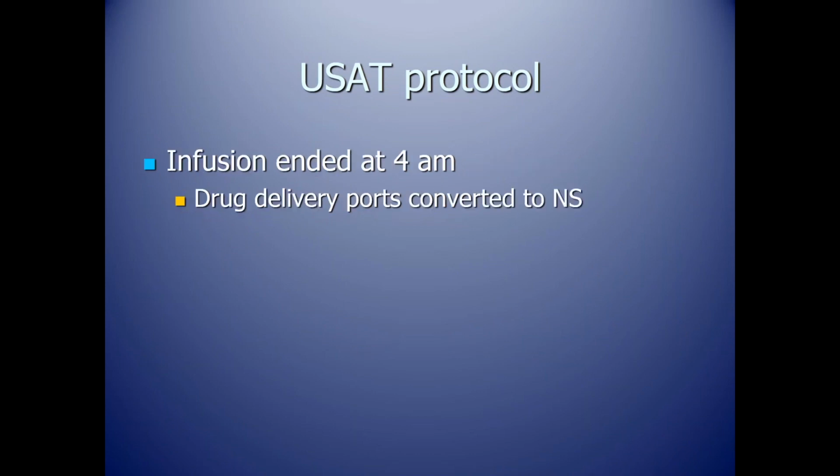And the reason we use that 12-hour infusion, or 12 milligrams through each catheter, is because we feel that that has been established as a very safe and effective dose. And I'll show you some of that data. It's not really a big data talk, but I'll show you that in a second. So this patient started the infusion at 4 p.m. The infusion of the thrombolytic drug ended at 4 a.m.